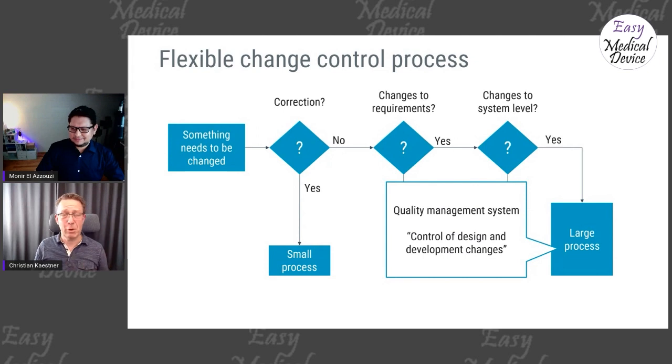So personally, I think it's very unfortunate that more or less all software now ends up in Class 2, but that's a different story. Yeah, different story, exactly.